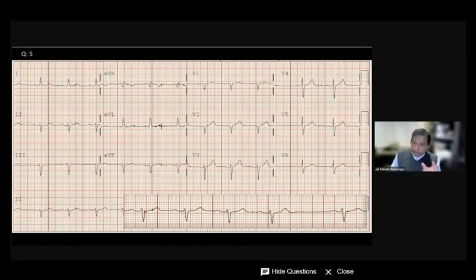So look at the preceding T waves. The key point here is you need to look in detail into the preceding complex. And if you're not sure, look around the other leads, because if you agree with me, you can see this T is a little different from the other. Now, you might say this is just a basic variation. It could be, but I can argue with this hypothesis, and it's difficult to refute that argument because you have a non-compensatory pause followed by this. There must be a hidden P wave here compared to the other. This is a little blunted compared to the other T wave. But anyway, let's keep learning.